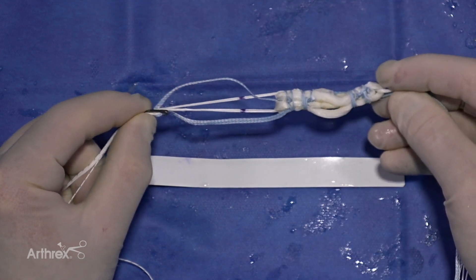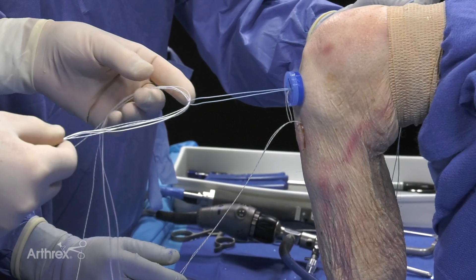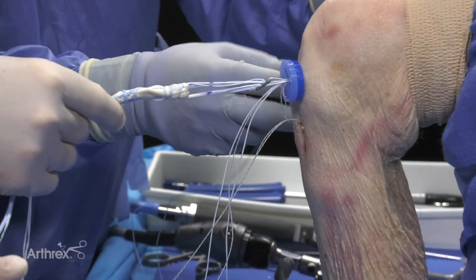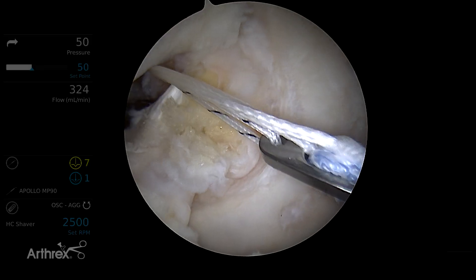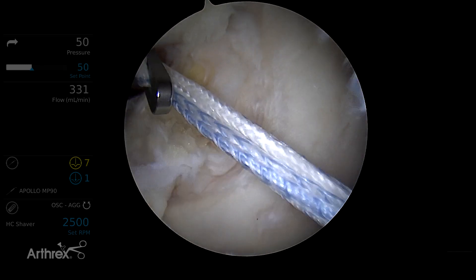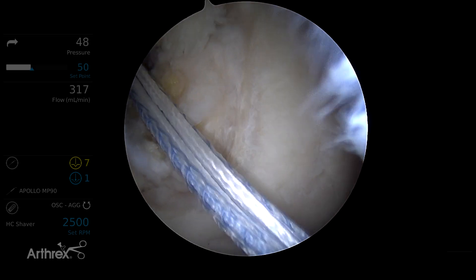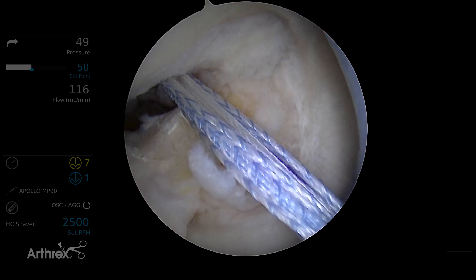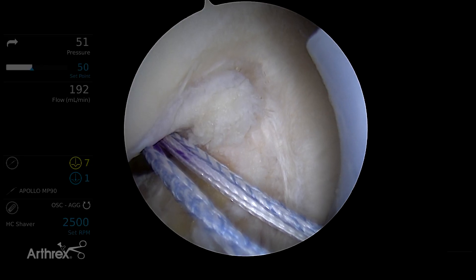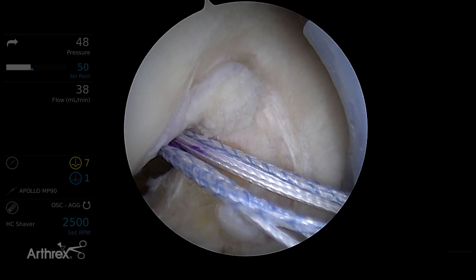When we see those blue marks pass into the femoral socket, we know the button will be outside on the femur and it'll flip easily, right on the bone — a nice way to do it without x-ray intraoperatively. So first we pull those four sutures out the femoral side, then put the scope back into the joint and watch the button pass. You can see the fiber tapes pass through the button as we did initially. We look for that little blue mark where we measured the intraosseous distance, and right at that point the button flipped right at the aperture at our 40 millimeters.